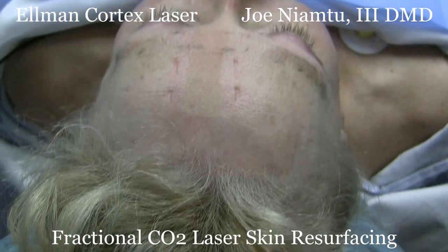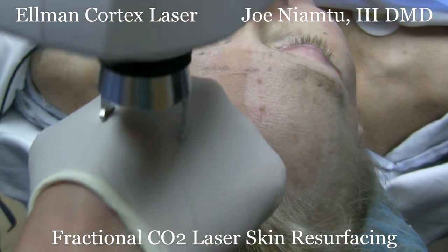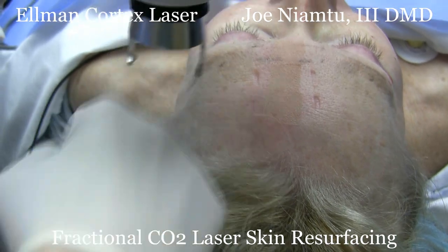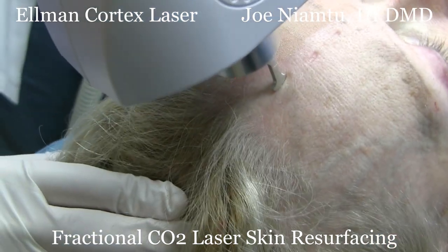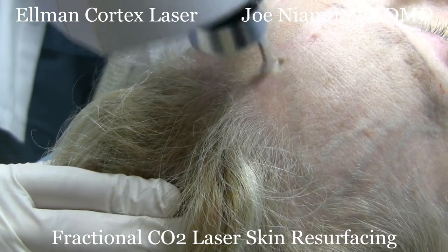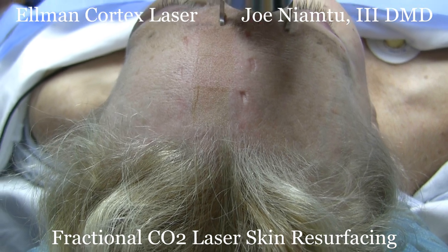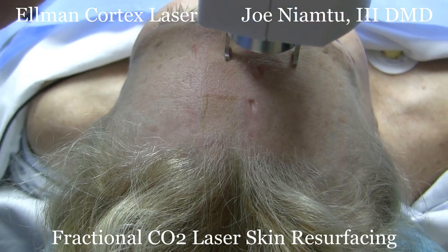You can actually see the square pattern. I'm turning it up on the laser and each time you turn it up it turns that off. You can see the square pattern on my hand. Using this large pattern size really expedites time. Now this patient is sedated, but we could frequently do this on awake patients as well. We have stainless steel corneal eye shields in this patient, which is extremely important.